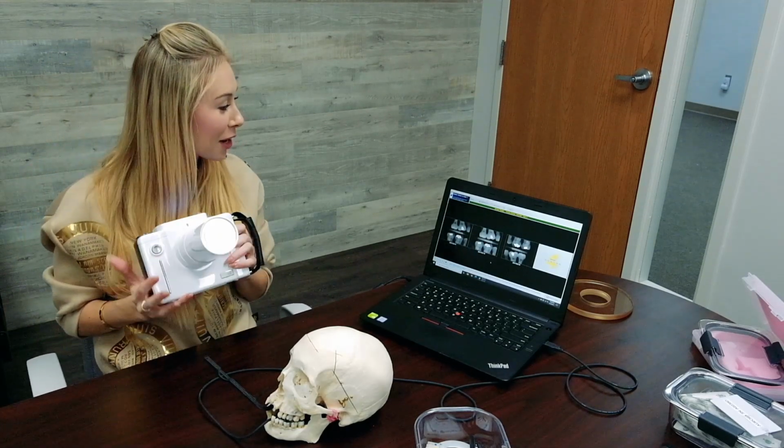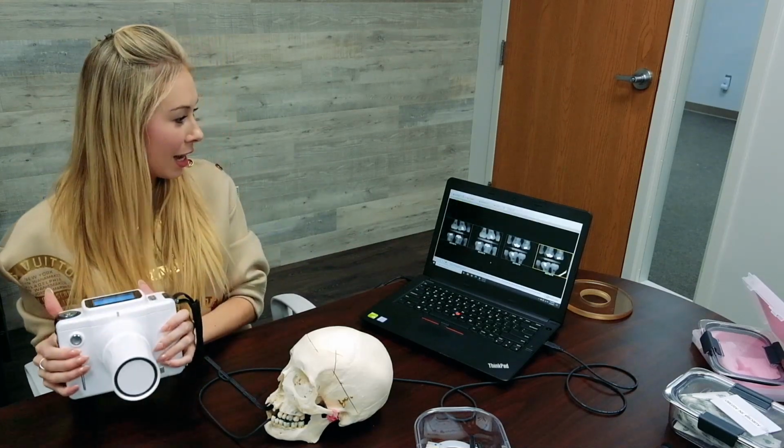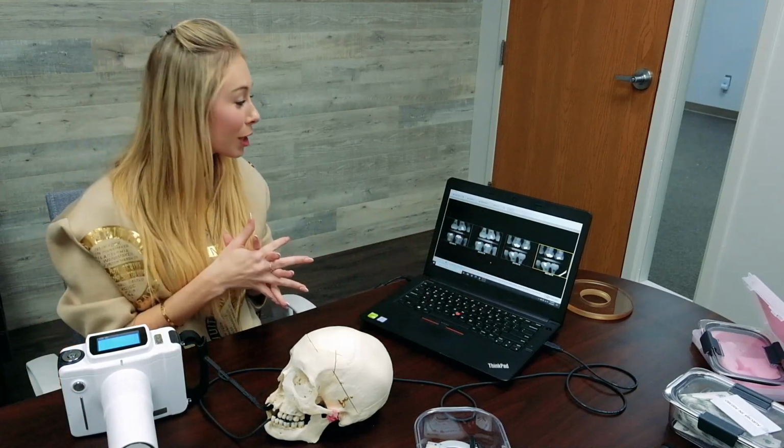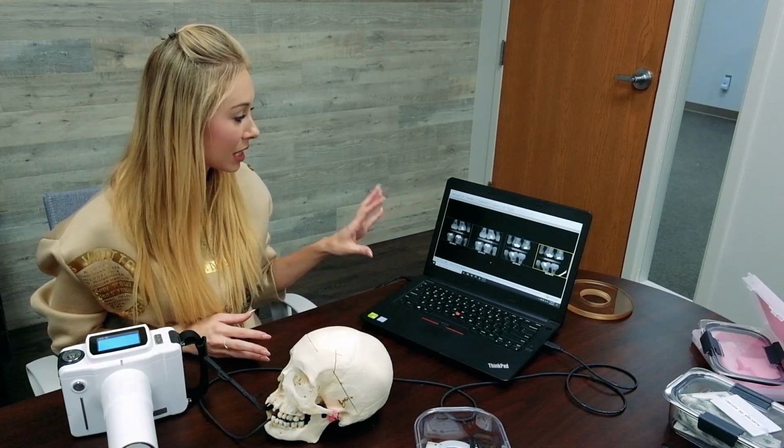It has been trial and error for me today, but I'm getting it down as we can see here. So I'm quite happy about that. And awesome. I got a little bit there, see? So I'm not a professional, but I'm working on it. So I'm really happy with how these turned out. And then when you guys are done here, we're going to go ahead and save this image series for Mr. Ed Bones for our 4 bite wings.